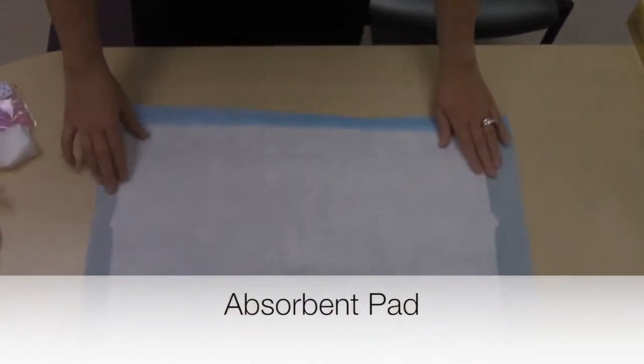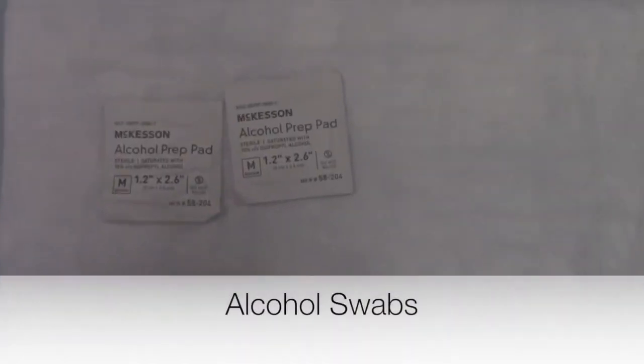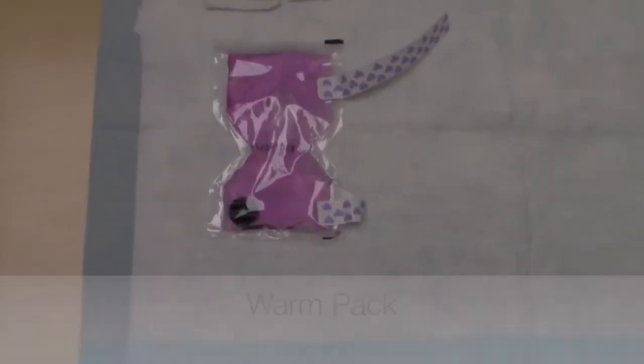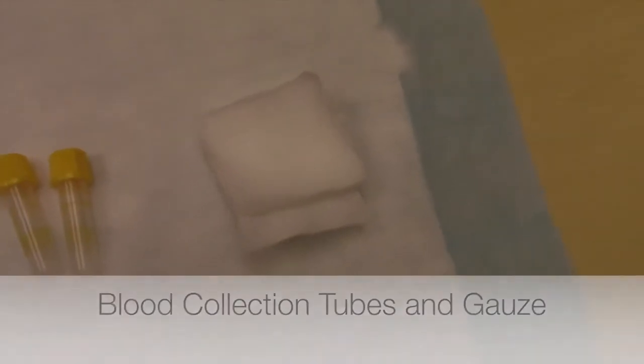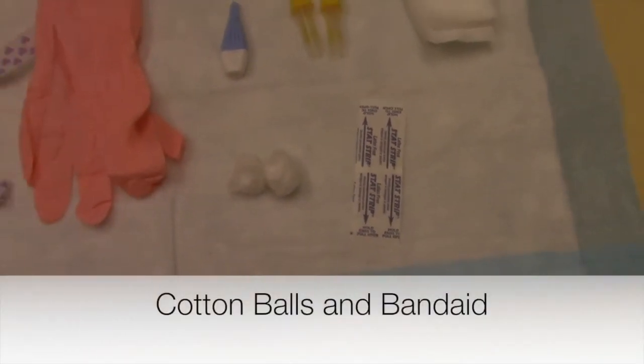You should have an absorbent pad, alcohol swabs, warm pack, gloves, lancet, blood collection tubes, gauze, cotton balls, and a band-aid.